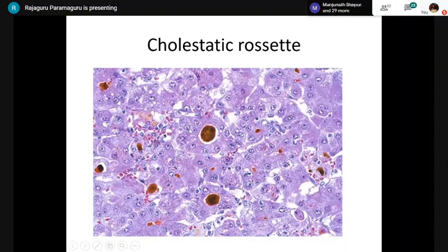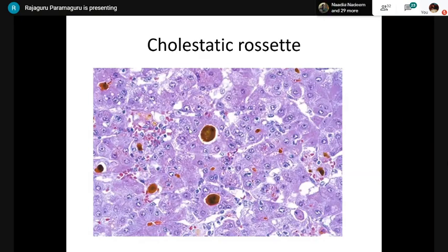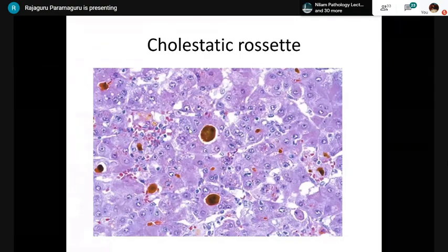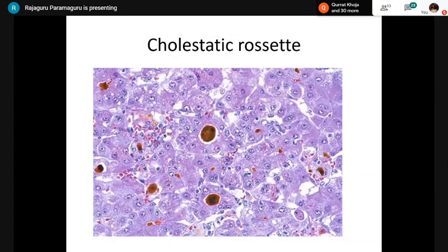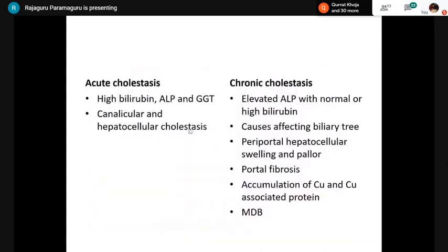Cholestatic rosettes without bile also indicate cholestatic liver disease — you need not demonstrate bile to diagnose a cholestatic rosette. Differentiate from hepatocellular rosette: if found without any inflammation or hepatocellular damage, you are likely dealing with cholestasis.